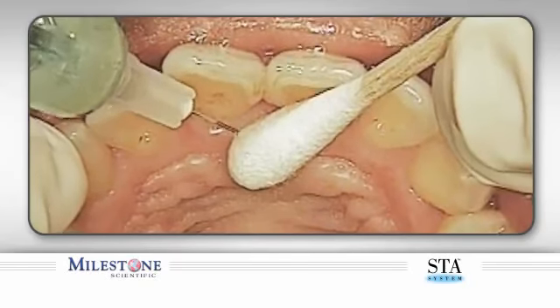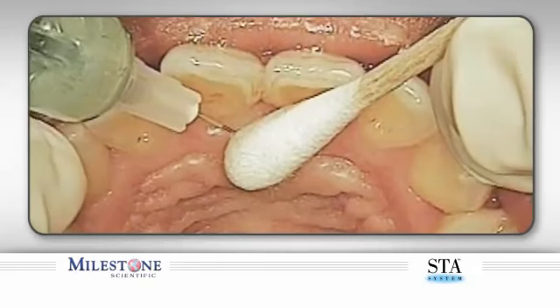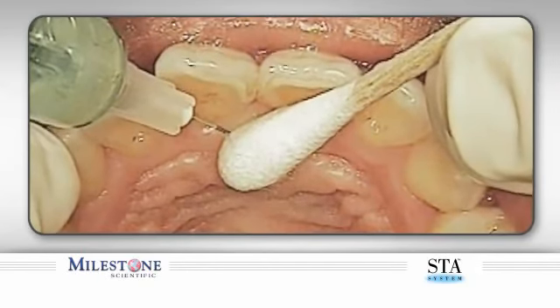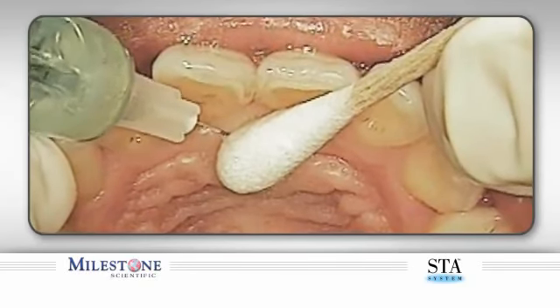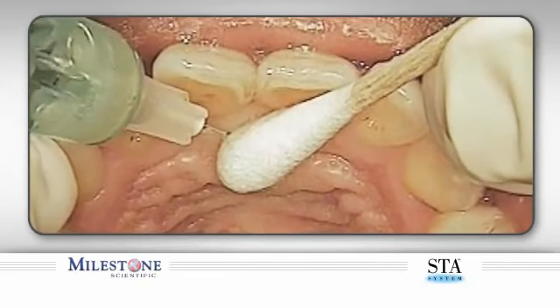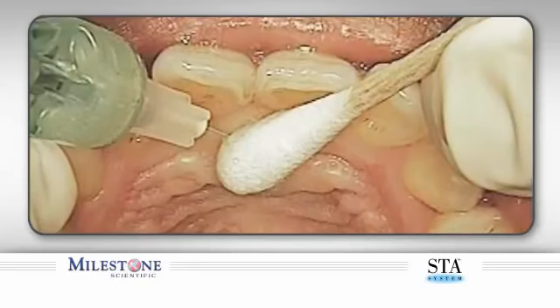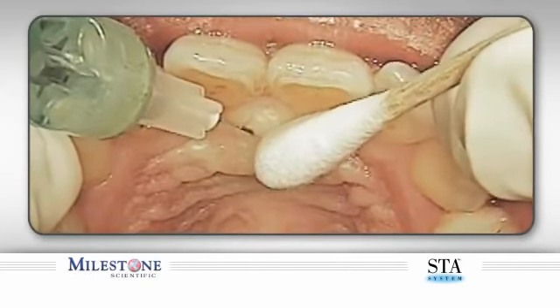After the papilla has blanched, reorientate the needle more vertically to gain entrance to the nasopalatine canal and continue to advance the needle very slowly while simultaneously rotating with bidirectional rotation. Advance the needle within the incisive canal 5 to 8 millimeters. All movements must be performed very slowly and gently. Do not move the needle more than 1 to 2 millimeters forward each time.